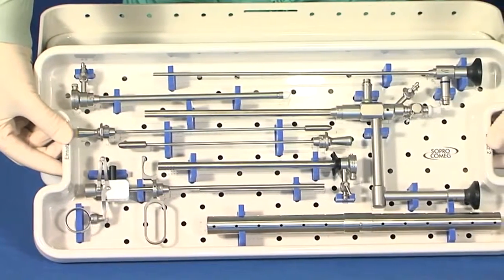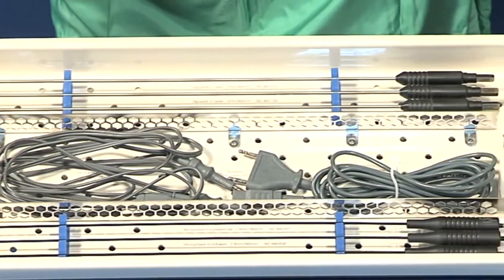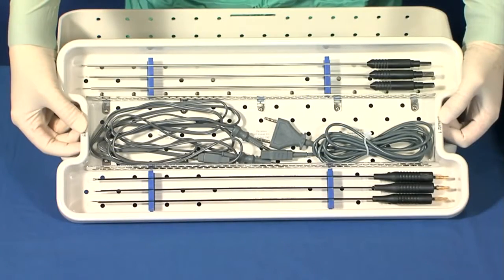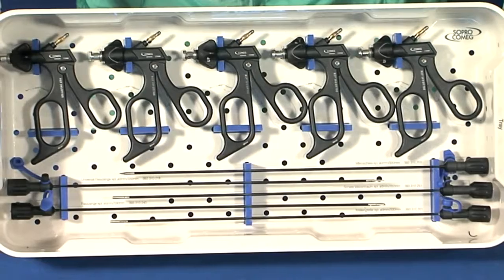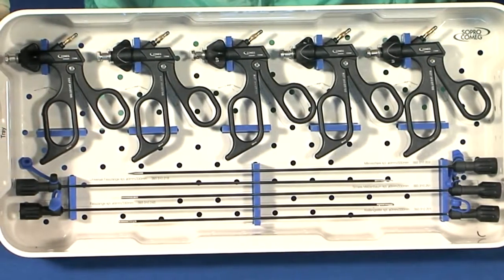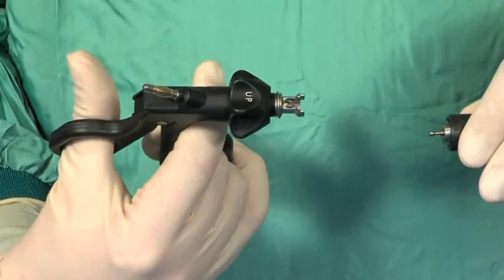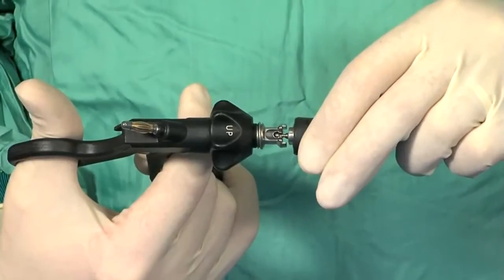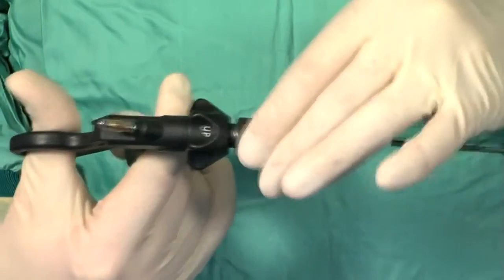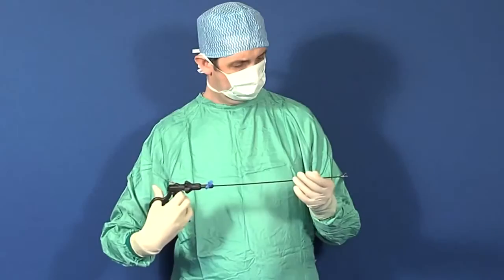The instruments supplied in the kit enable work to be performed either in monopolar electrosurgery or using only the mechanical energy, particularly for myoma enucleation. The forceps and surgical scissors are composed of an insert and a hand grip made detachable to ensure impeccable hygiene. When assembling the instruments, the hand grip must be held open and the ball of the insert introduced into the slot designed for this purpose. The hand grip must then be closed and the insert ring screwed on. Proper functioning of the instrument must be verified by activating the hand grip.